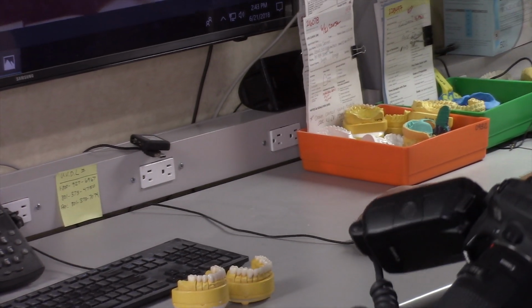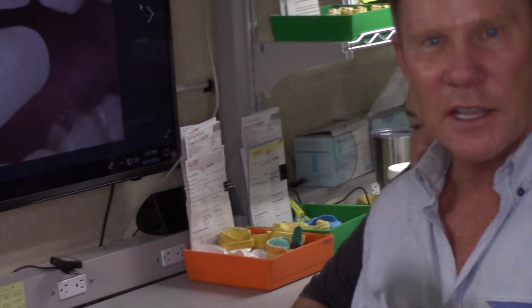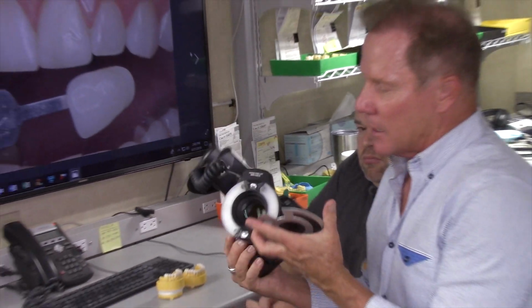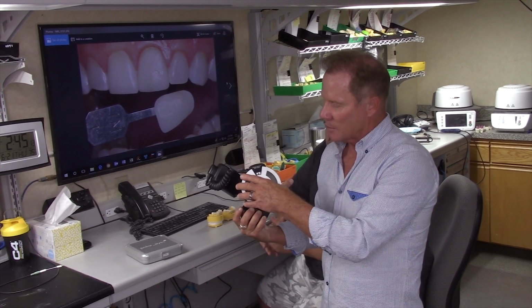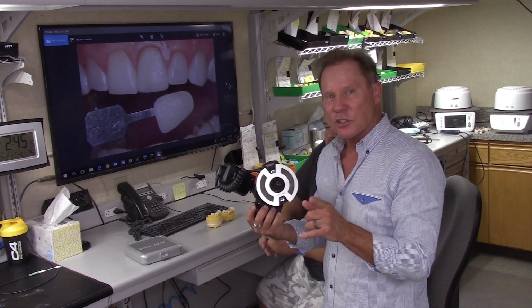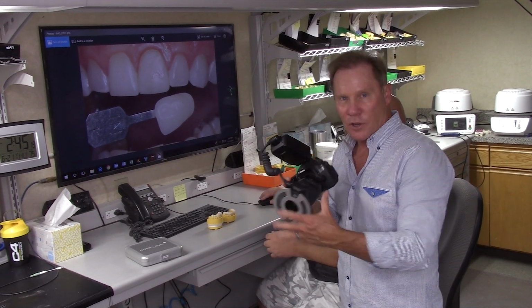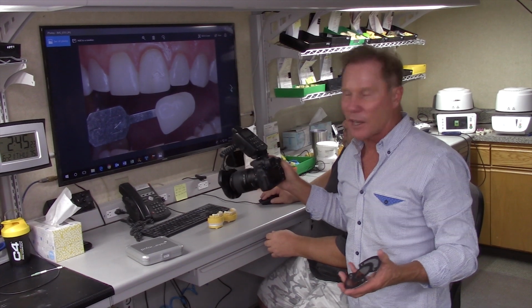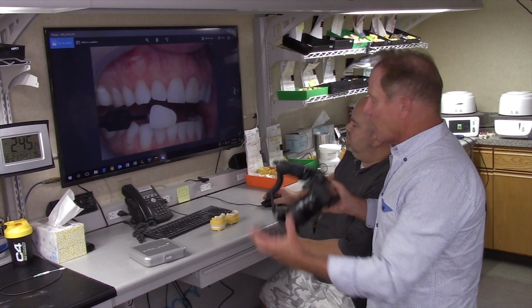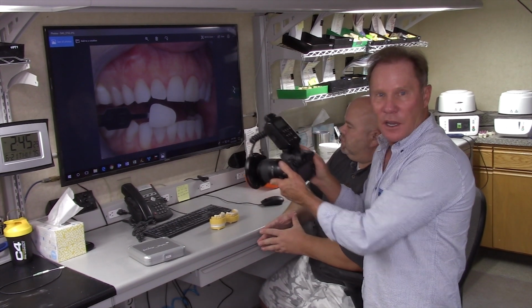What it is, it looks like this, and it's polarizing filters, and it comes with these little magnets that you attach to your ring flash, and it just snaps on there. So what I like to do is take a regular photo with the full ring flash, you can get the most amount of light with the shade tab, and then I'll put the Polar Eyes on there, and I will take another photo.